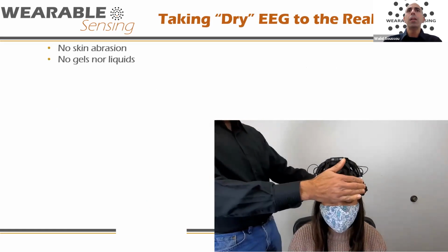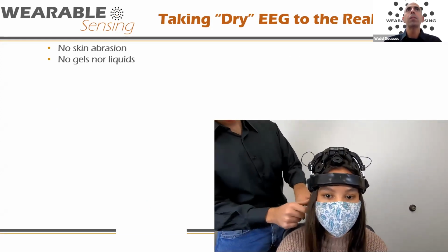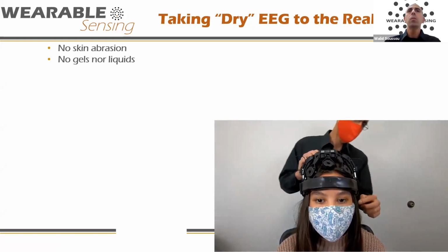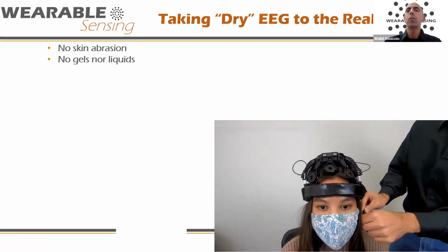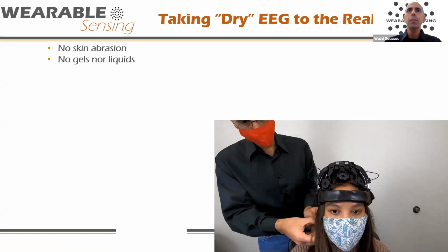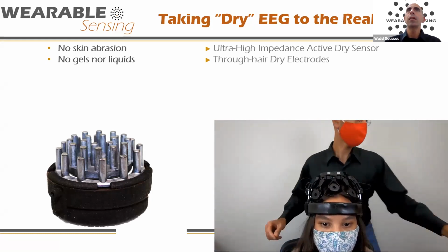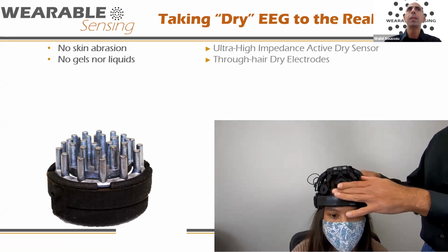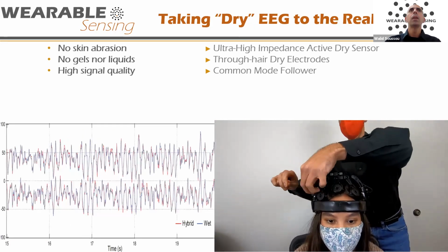Quasar had a mission initially by DARPA, later NASA, NIH, NSF, and various other government funding organizations funded different aspects of this technology development. The first mission was to take our high sensitivity, low noise capacitive electrodes that we had developed for cardiac sensing and other applications and deliver a dry electrode EEG. So we took those sensors, we added the resistive element to them, we gave them some ultra-high impedance amplifiers, some custom circuitry, put some pins made of silver chloride, and we developed dry electrode EEG.